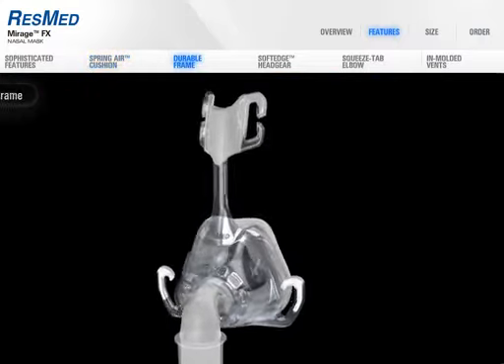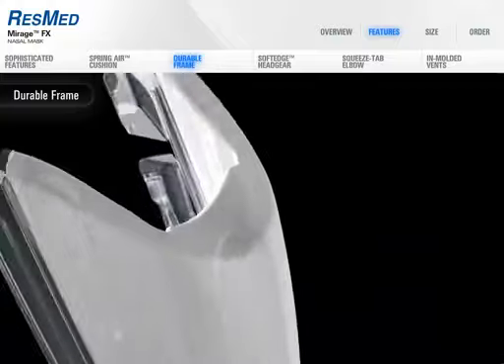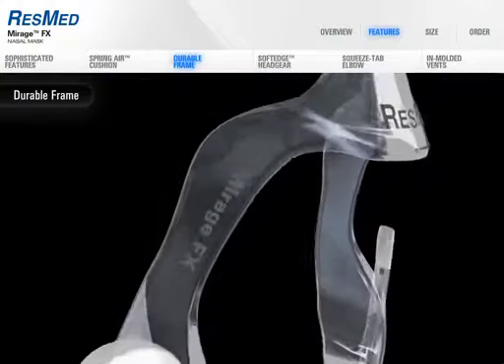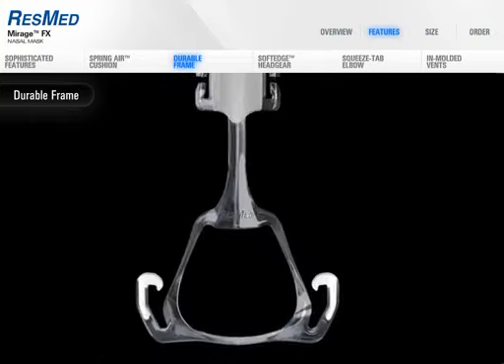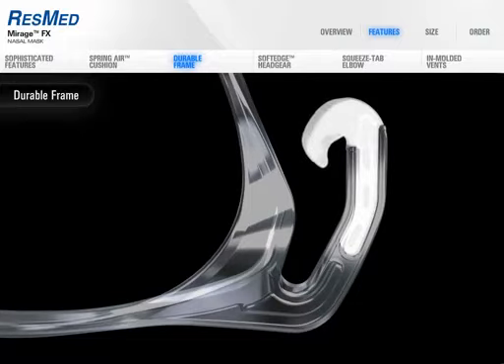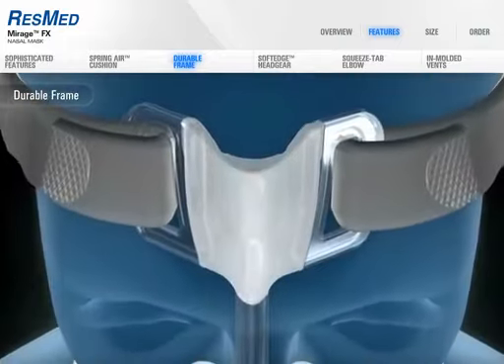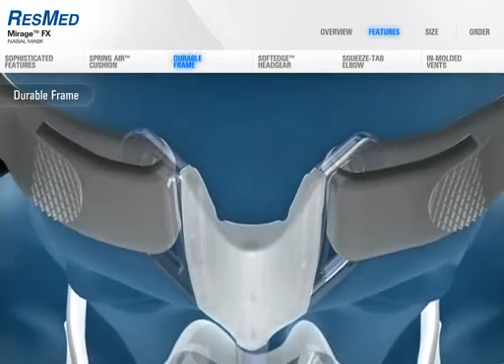Made from durable, flexible, and lightweight material, the Mirage FX frame can withstand the toughest treatment. Overmolded headgear loops replace conventional headgear clips at the top and bottom, making connection easy and adjustment quick and intuitive. The flexible winged forehead support allows a dynamic range of fit and adjustment without contacting the skin.